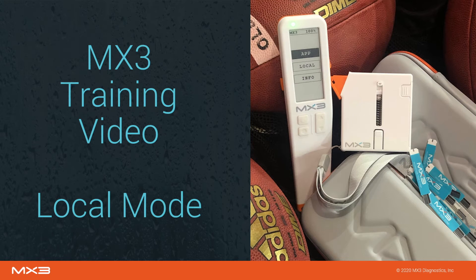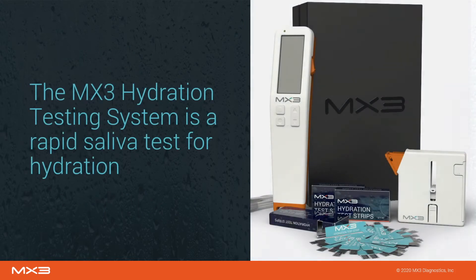Welcome to the MX3 training video. This video will introduce you to the MX3 hydration testing system and teach you how to take measurements in local mode. The MX3 hydration testing system is a rapid saliva test for hydration. Think of it as an alternative to urine specific gravity for hydration assessment on the worksite.